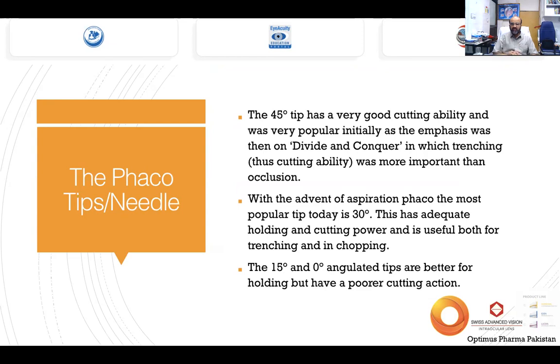The more beveled the tip is, the better shaving and cutting ability it has. And the more straight it is, like 0 degrees and 15 degrees, the better their holding power is.